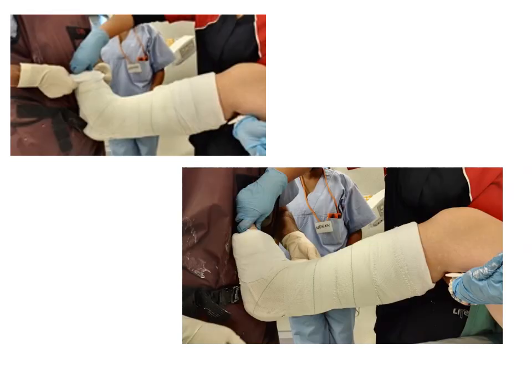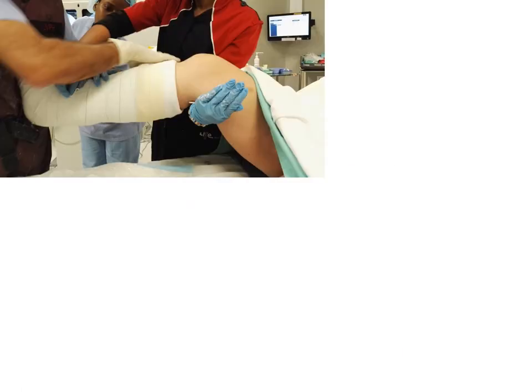The first Elastoform is rolled over, then the stocking net is peeled backward over the edges. The second Elastoform is rolled over to make a neat construct, followed by the Elastoplast starting at the top and going from proximal to distal — one entire roll of Elastoplast is utilized. The result is a back and side slab that is far more comfortable for the patient than the original inadequate backslab.